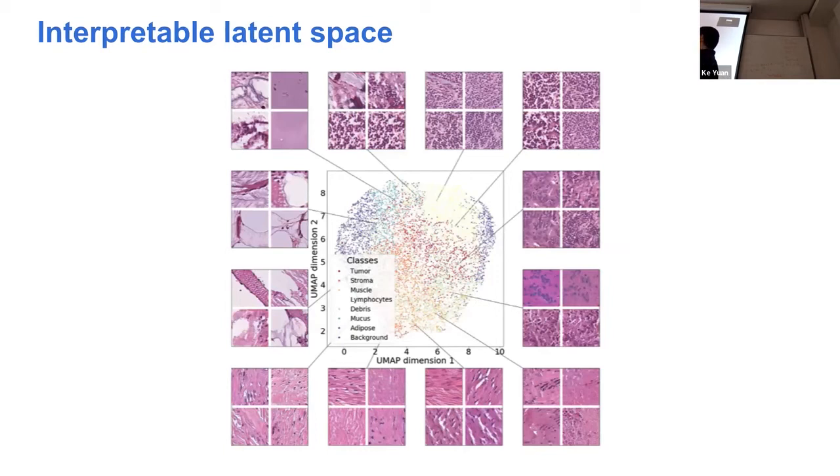Similarly, you might be wondering why I didn't use HoverNet to get the cells. I will have an answer for that later. But using colon cancer as an example, you see that drastically different morphology seems to be still separated in this latent space.